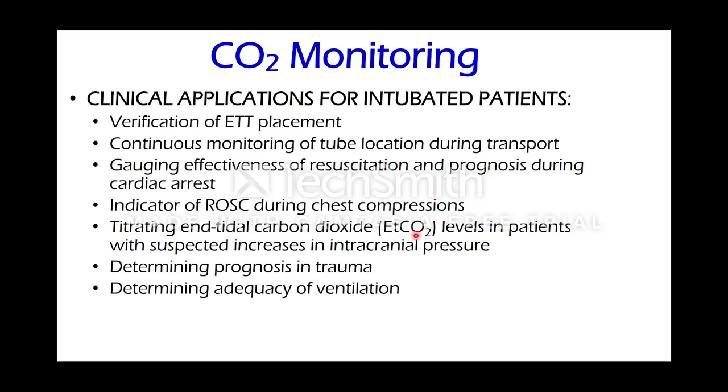Titrating end-tidal CO2 level is very important in patients with suspected increased intracranial pressure, to control CO2 during the management of the increased intracranial pressure. It also has a very important component in the prognosis of trauma patients, and it gives us an idea that we are ventilating the patient, especially a patient connected to a ventilator.